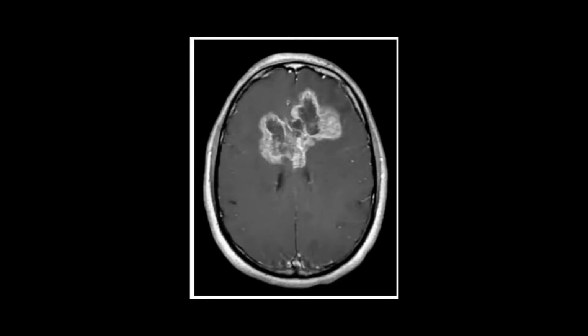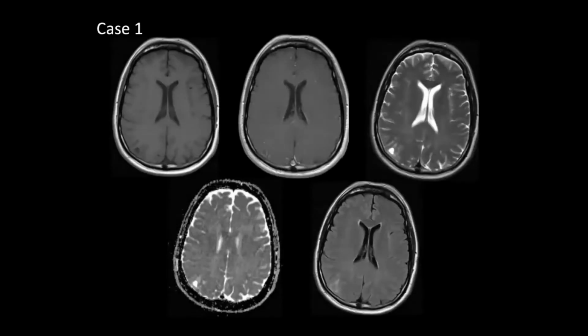Because what we found is that all the glioblastomas with PNET features are similar to each other. So basically we have almost always the very same morphology on imaging. And it is different from a glioblastoma multiforme without PNET features, which is this one, a very aggressive tumor, infiltrating, really heterogeneous. So now we're going to see 5 cases of GBMs, glioblastoma multiforme with PNET features.